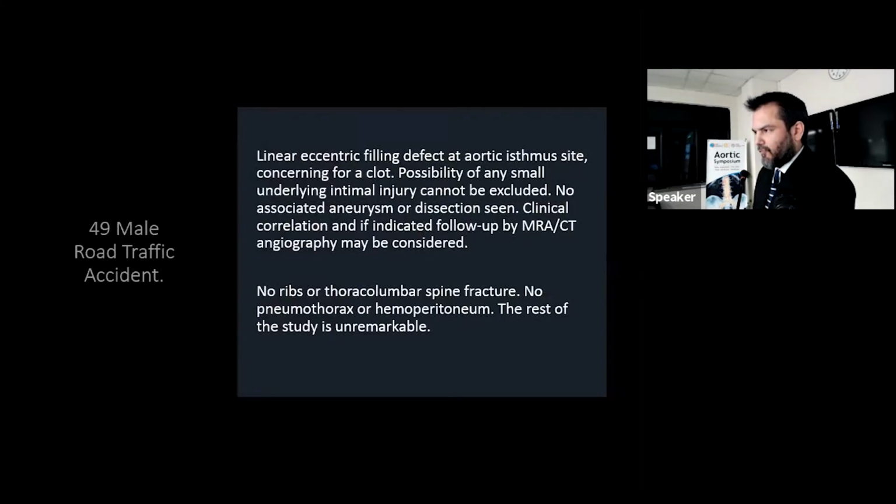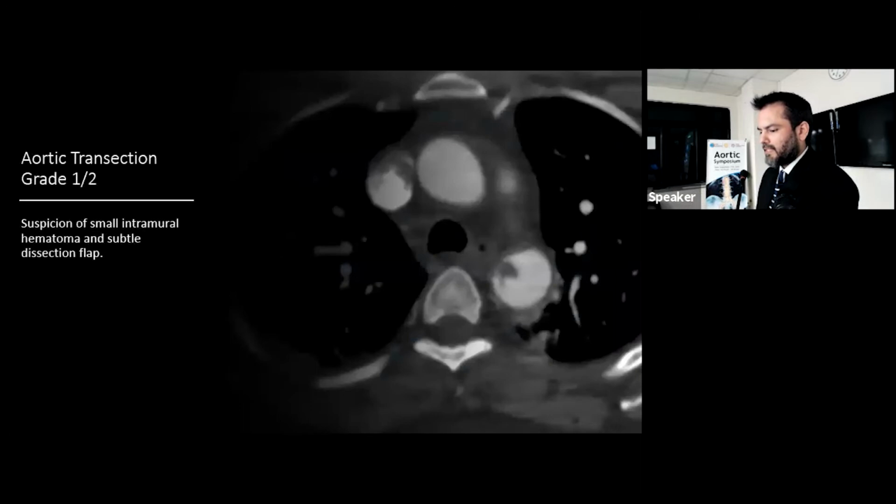I've gone through many of our CT reports at Shifa, and I think the reports are quite good. They give very good descriptive information about what's happening within the aortic arch, and then the same description is put at the end, and often it's quite a lengthy report. In this particular patient, we can see that there's a grade 1.